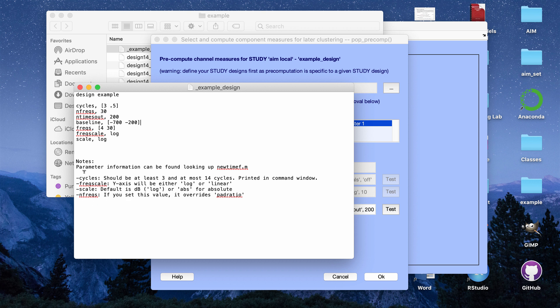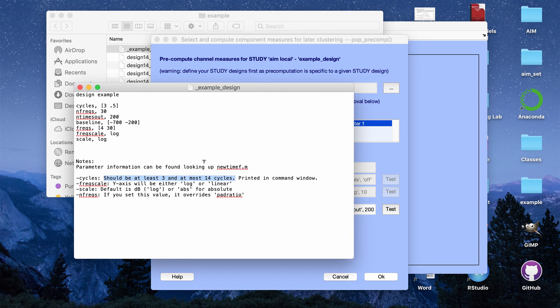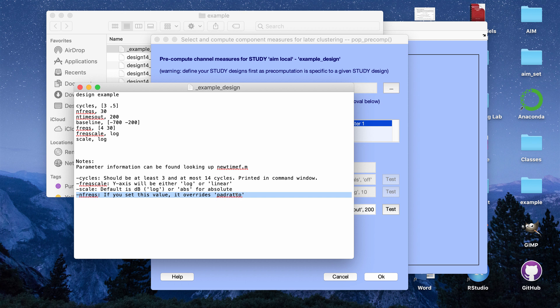Some notes: cycles should be between 3 and 14 as the highest, and when you run this command MATLAB's command window will print out the actual cycles used. The frequency scale sets the y-axis to log or linear — which you choose depends on whether you want to emphasize higher or lower frequencies. The scale parameter sets power in decibels or absolute power; we typically want log for decibel power. Setting number of frequencies will override the pad ratio parameter.